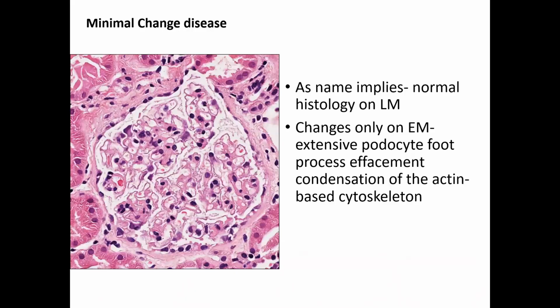So starting with minimal change disease. What do you mean by minimal change disease? As the name implies, minimal change or no change. So we will not see any changes in the light microscope. The glomeruli will be normal. So here we can see just the normal morphology.